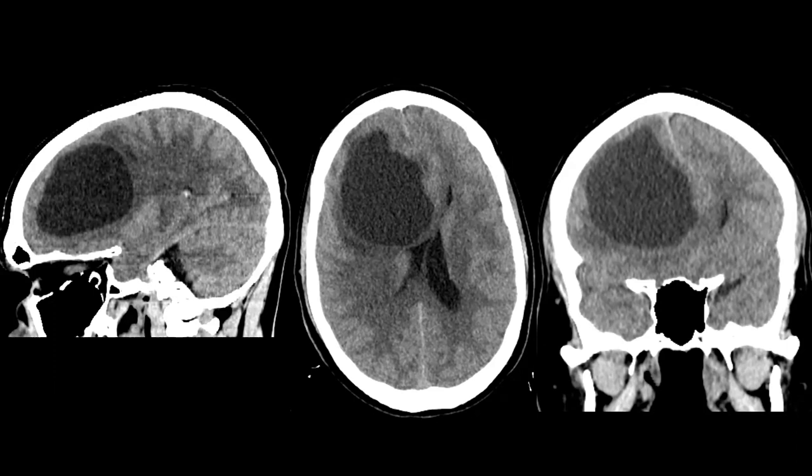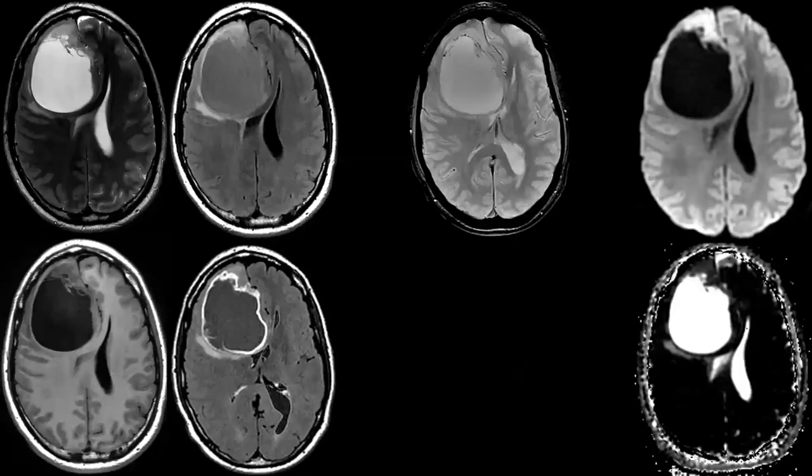Dr. Singh is also reading out. I'll tell you, okay, this is CT, sagittal, axial, coronal CT, really large mass, either cyst or necrosis. All right, moving on. Okay, upper two panels, what you have is the T2 and T2 FLAIR. Immediately below those, T1 with contrast. The single in the middle is a T2 gradient echo, which shows essentially no hemorrhage, no calcification.